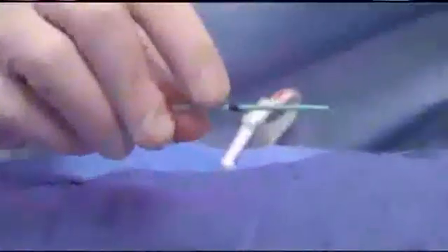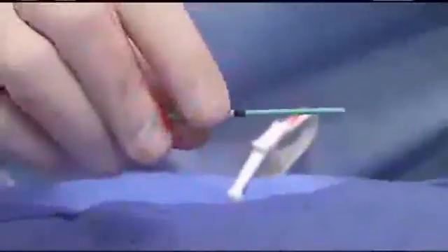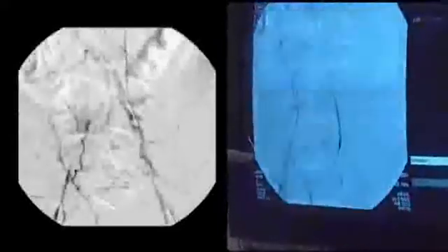The sheath that I chose to use today has an opaque marker on it — it's called bright tip. This will allow me to identify where the sheath is, especially when you have a lesion that's very close to the access site, and allows me to position my sheath very close to the chronic total occlusion. It's identifying that the common iliac is 100% occluded with complete occlusion of the external and internal iliac, with only reconstitution at the common femoral. We now have dual access: 6 French bright tip on the right and 6 French on the left.